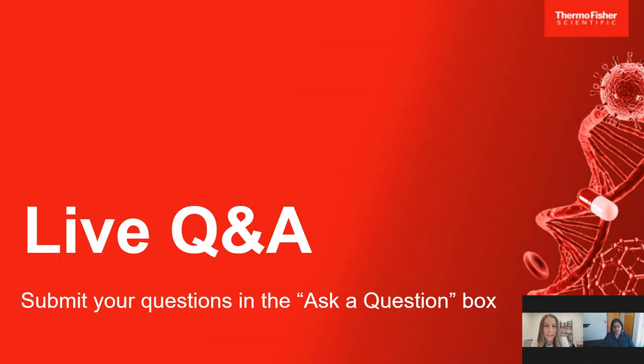Great, thank you. And a related question: do we need an antigen retrieval step for frozen tissue? Yes. If you are trying to stain antigens that are in the intracellular compartment, it's better to use the antigen retrieval step because you want your antibody to reach them internally. So in that case, I will recommend using antigen retrieval on the frozen tissue. I have personally used that and I find it works beautifully and gives you a crisp staining.